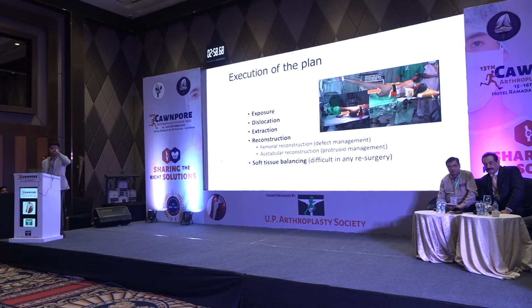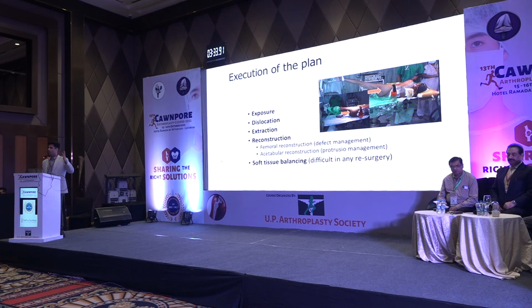So how do you execute it? You have to have decent exposure. So my advice to all surgeons, learn how to do the hip replacement through the posterior approach, through the direct lateral approach, and if you can, also through the anterior approach. So learn all the ways to do it because you may need to do dual approaches, you may need to change your plan intra-op. There are going to be problems in dislocation. There are going to be problems in extraction. Be prepared. You have to reconstruct both the sides and you have to make sure you don't cause defects and you must know how to manage those defects. Protrusio is a big problem with hemi-arthroplasty, especially the older Austin-Moore prostheses, Thompson prostheses, and sometimes with the bipolar. And of course, the key to a good surgery is a good soft tissue balancing.